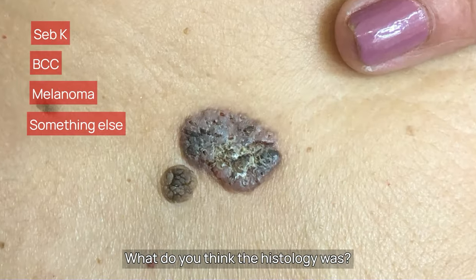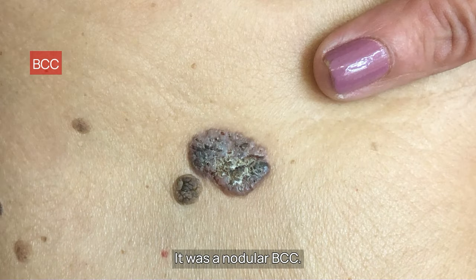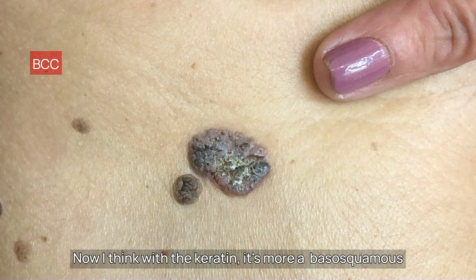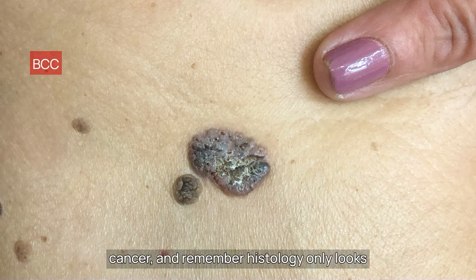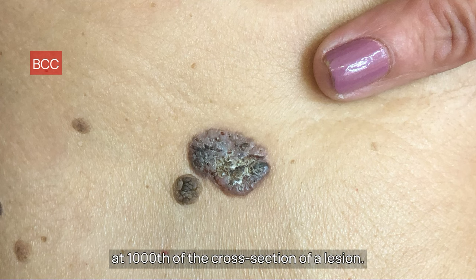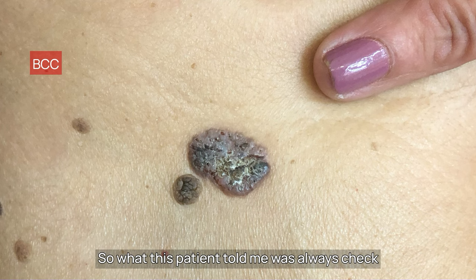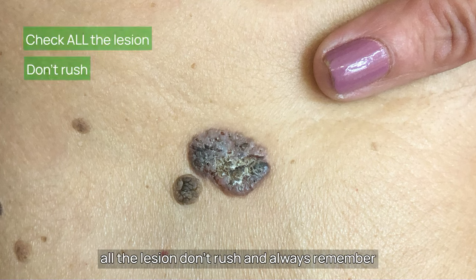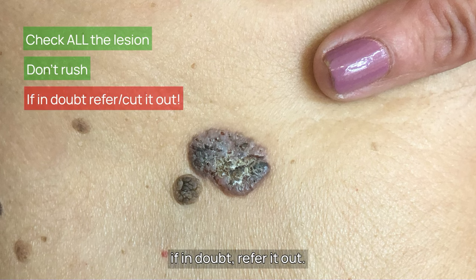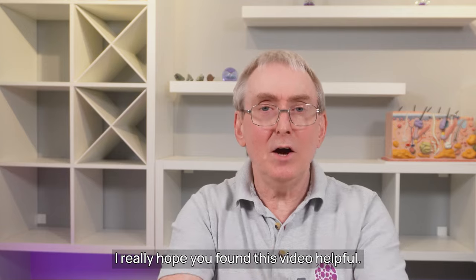It was a nodular BCC — that was all it said on the report. I think with its character it's more a basal squamous cancer, and remember histology only looks at one-thousandth of the cross-section of a lesion. The smaller lesion was confirmed as a Seb K. What this patient taught me was: always check all the lesion, don't rush, and always remember the first rule of primary care dermoscopy — if in doubt refer it out, or as in this case, cut it out.